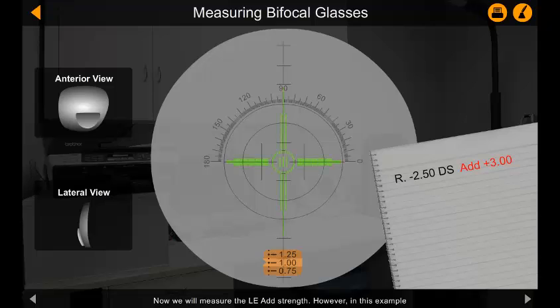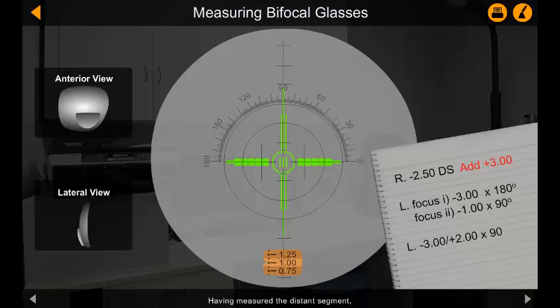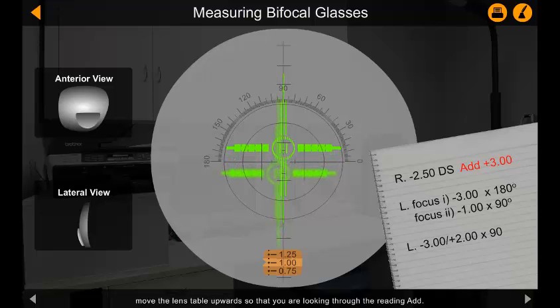Now we will measure the left eye add strength. However, in this example, the left eye lens contains a cylinder and will require a slightly different approach. Having measured the distance segment, move the lens table upwards so that you are looking through the reading add. The add will appear as though it is a cylinder, but do not forget that it is a plus sphere on top of the distance segment.